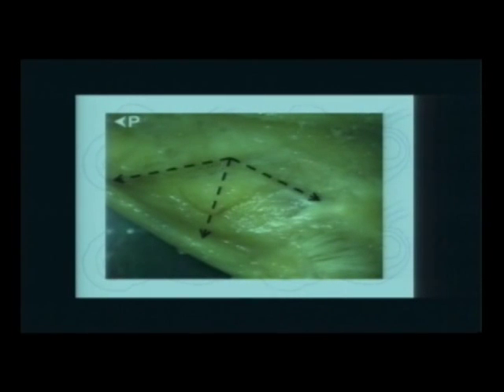So, here is the vestibule. Anterior to this line is the cochlea. And this is the corridor where the facial nerve is going to pass through here. Where is the internal auditory canal? This is the internal auditory canal. All this is dotted. We haven't seen it.